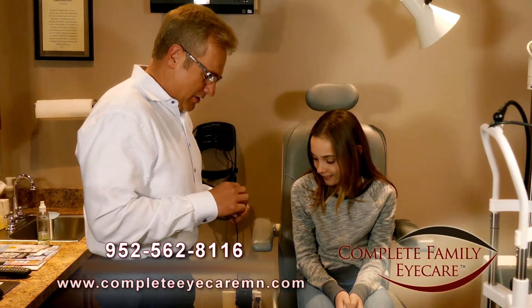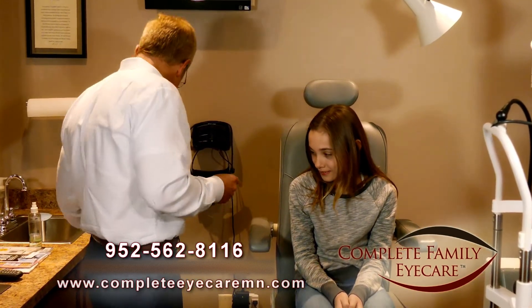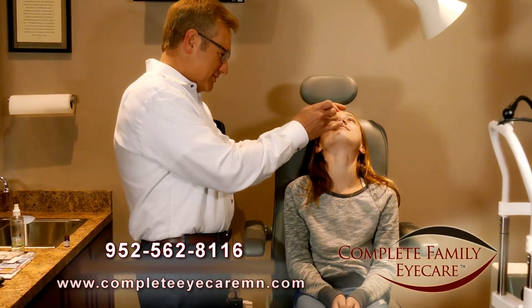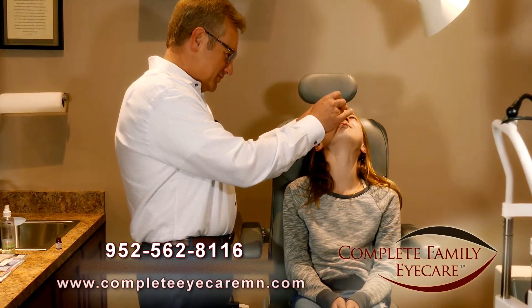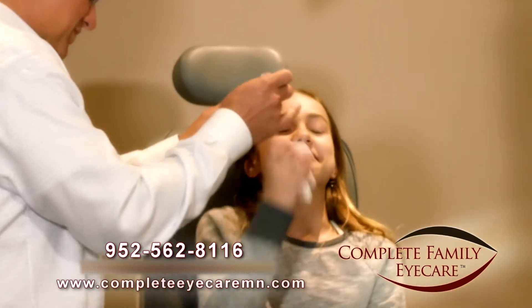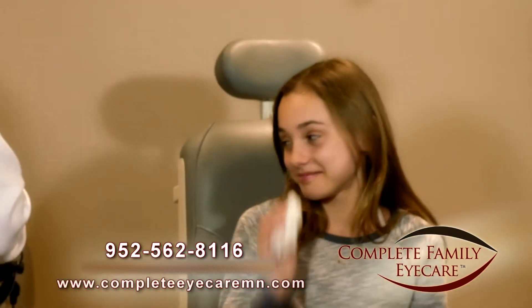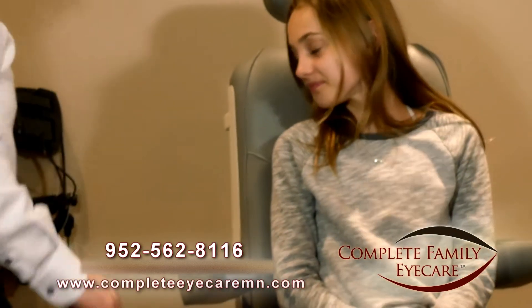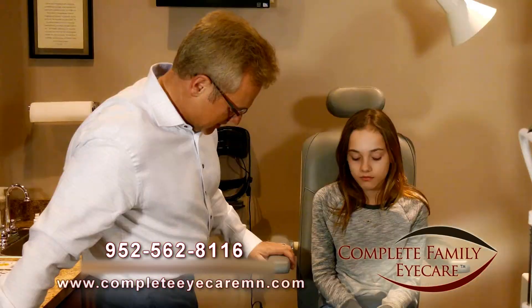First off, I'm going to give you a little eye drop — the eye drop kind of makes the eye numb. Chin way up and head back if you would. One, two, three — boop. Here it comes. Go ahead and blot your eye with the tissue. Good job, Belle. So that makes the surface of the eye numb — a little anesthetic, very safe.